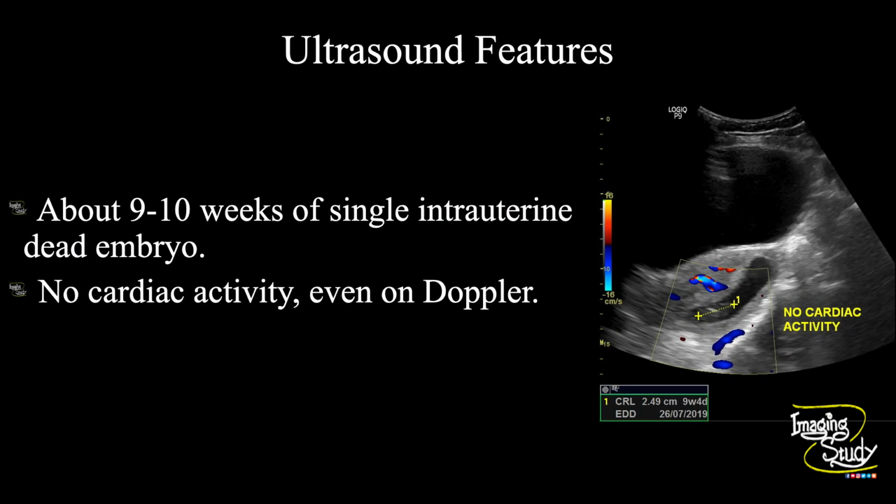So in summary, about 9 to 10 week sized intrauterine single dead embryo is seen. There is no cardiac activity even on Doppler. So these features conclude it as a case of missed abortion.